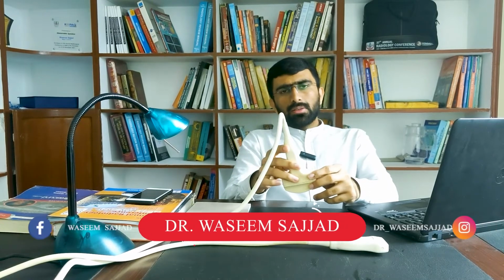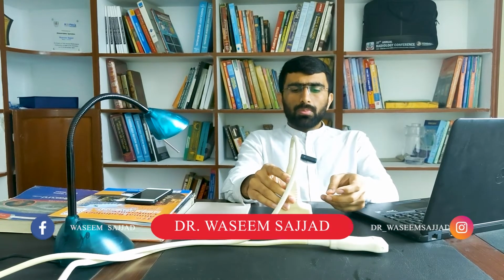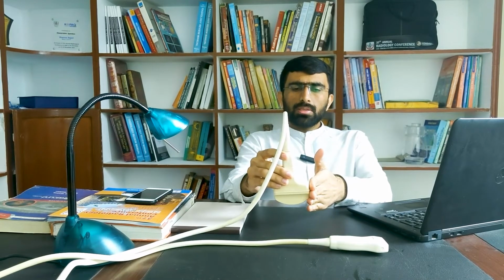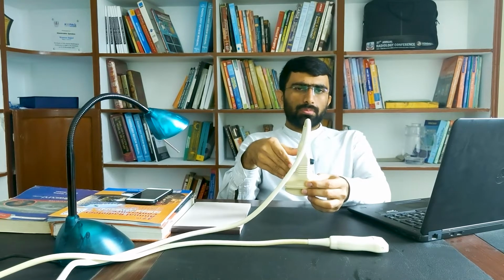In the previous lecture we discussed that if we place the probe on the human body like this, then the structures inside the human body which are under the pointing end appear on the pointing side of the screen. Similarly, there is a pointer on the screen which indicates that this side of the screen shows the structures alongside the pointing end of the probe.